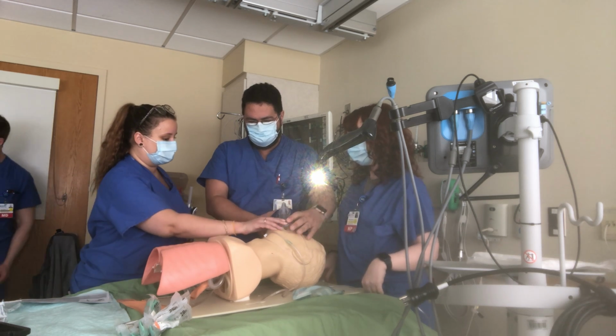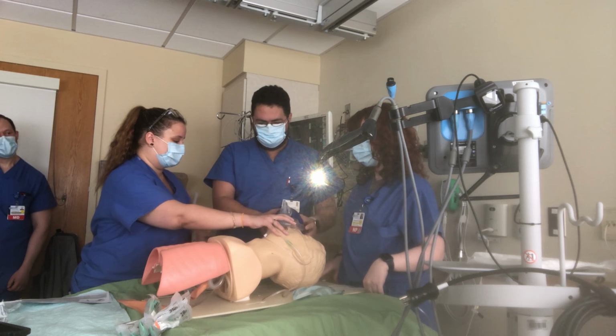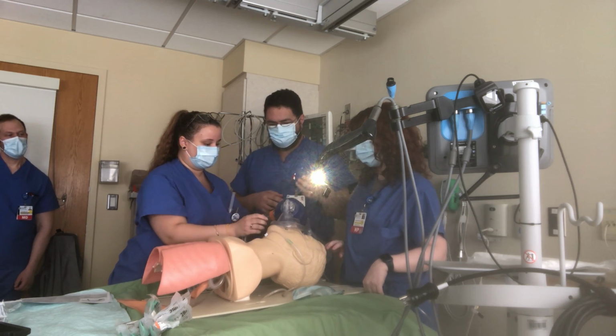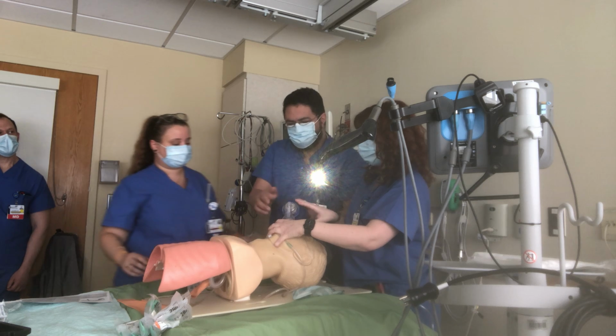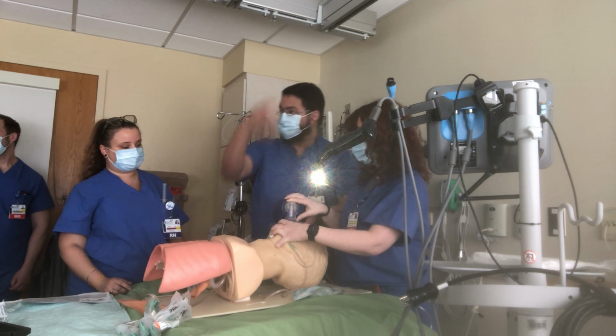I'm trying to ventilate. Am I ventilating correctly? How do I ventilate correctly? Yeah, but where do you put your fingers? So from here, Trish, put your finger. Where do you put the little finger? Little finger under the mandible. These two fingers here. Pull up.